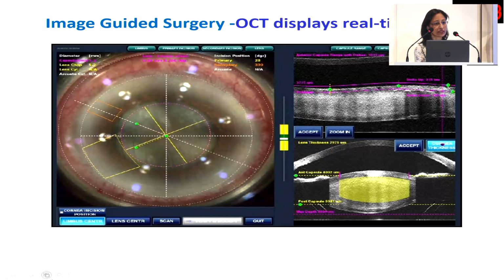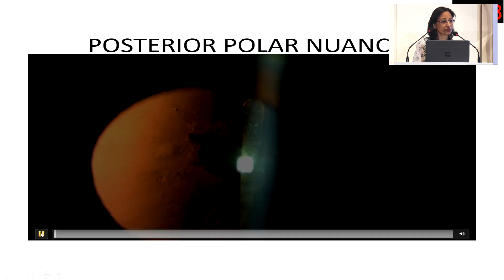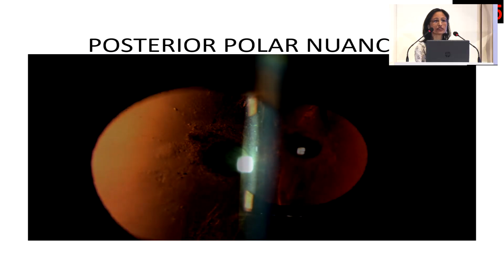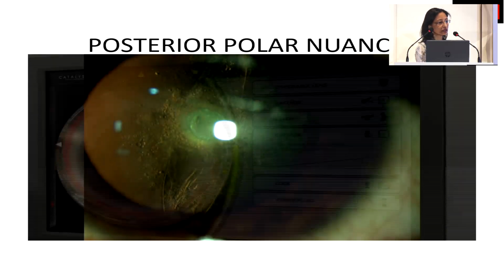Now all the femtosecond lasers also have real-time OCT integrated, and that feature is very useful when we deal with posterior polar cataracts. Video please. So this was a case where the patient has posterior polar cataract with pre-existing capsular rupture.